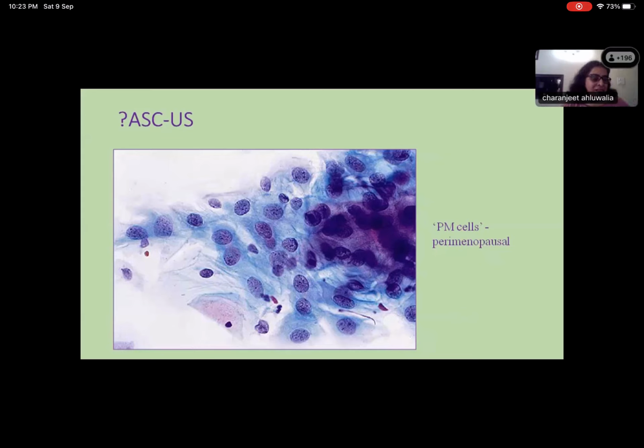And then, as he described about koilocytes, he said there is perinuclear cavitation. Yes, it usually occupies more than two-thirds of the cytoplasm, and the cell outlines in a koilocyte are markedly thickened because of peripheral condensation of the cytoplasm. The perinuclear cavitation or perinuclear halo, we don't usually use the term halo. So it's a cavitation, and it should occupy more than two-thirds of the cytoplasm.